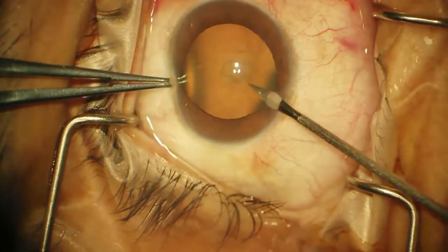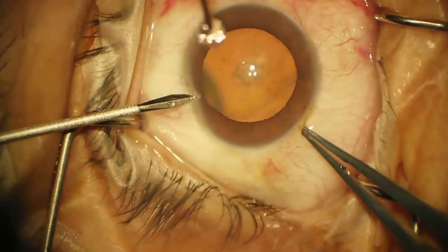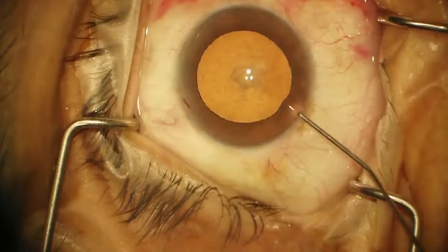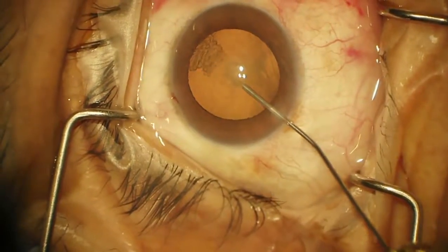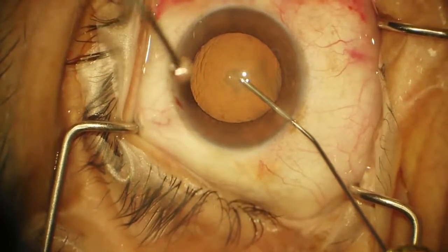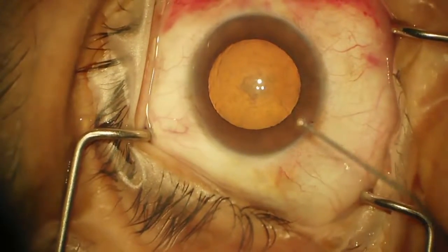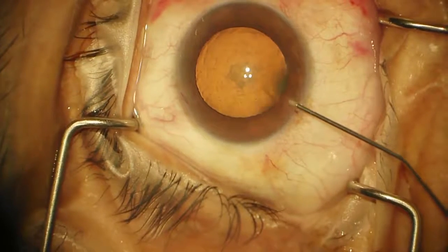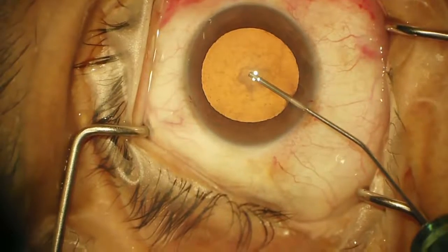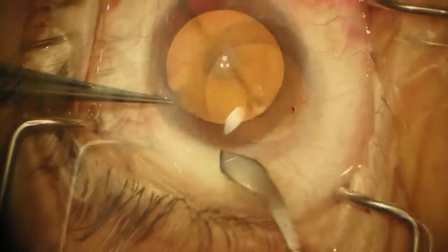There's really nothing special — you can see it's a combination of a nuclear sclerotic cataract and you can see the posterior subcapsular component. Next I will put in some viscoat and fill it about two-thirds full with viscoat and then one-third full with Provisc. What that does is the Provisc forces the viscoat up against the endothelium and at the same time lays a surface down on the capsule.